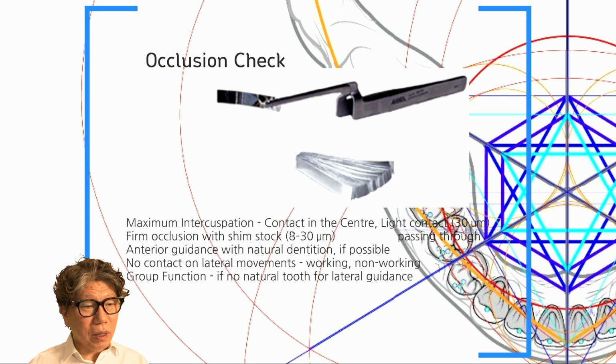Therefore, when looking at the occlusion paper, one should not just capture the implants and prosthetics that he has done, but also examine the remaining teeth, opposing teeth, and even observe the occlusion points on the opposite side as a whole. And it is necessary to conduct a strategic qualitative comparison analysis.